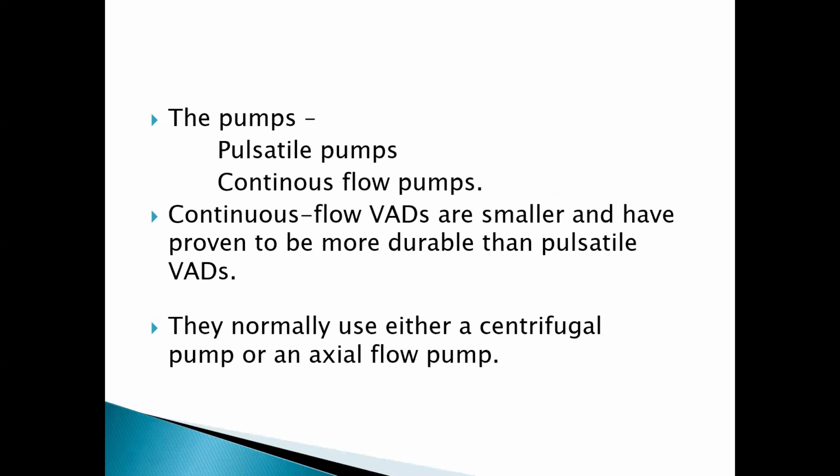The continuous flow pumps are the newer version. They're smaller and have proven to be more durable than the pulsatile pumps. Continuous flow pumps work through either the centrifugal pumping system or the axial flow pumping system.